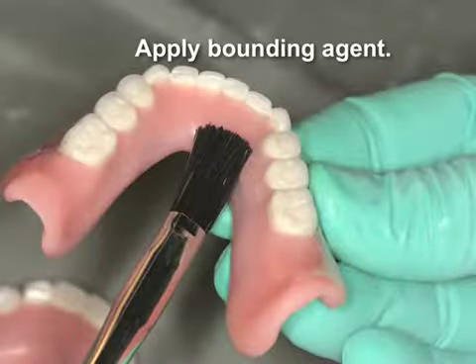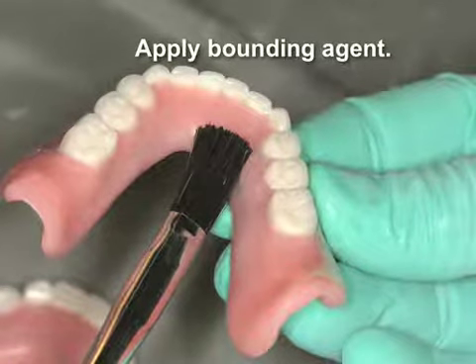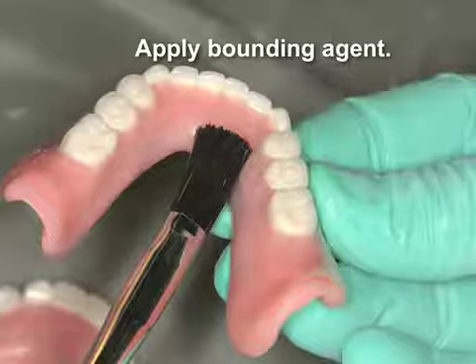It is important to apply a small amount of bonding agent prior to adhering the light-cured material onto the denture.